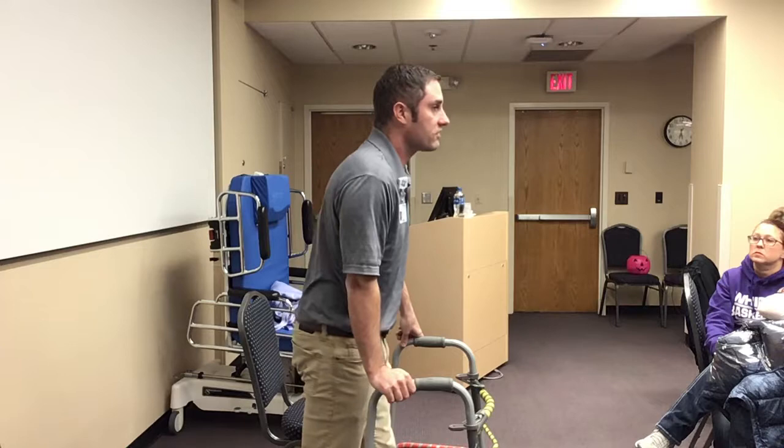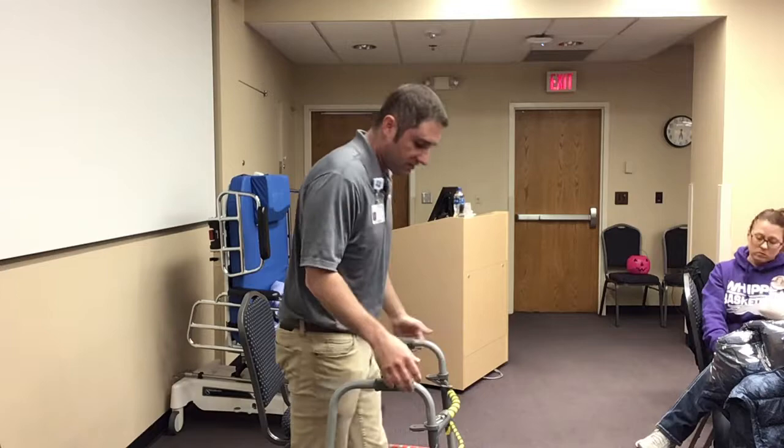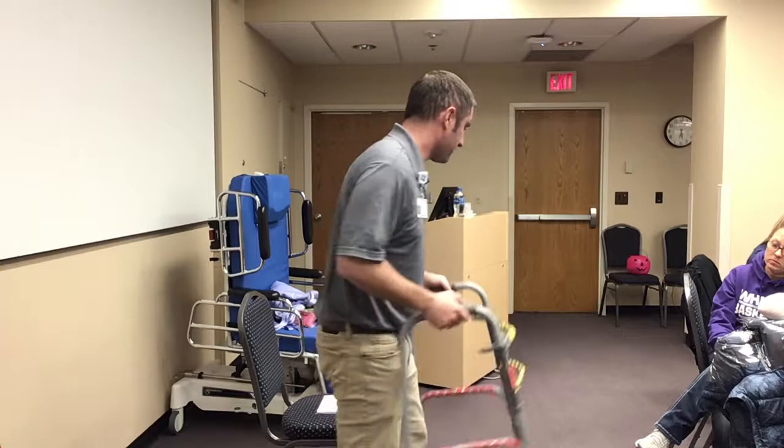Weight-bearing as tolerated is just as much weight as they can tolerate. The walkers are what you're going to see 97% of the time here. It's the safest device, mostly because it has four points of contact that provide a really nice, wide base of support. You can hang on this thing — it doesn't really move. It's a very stable device.